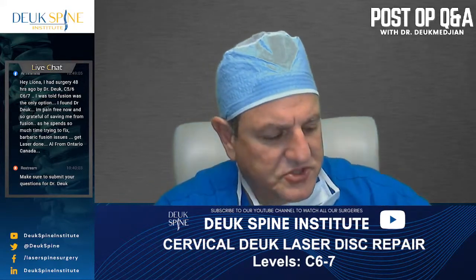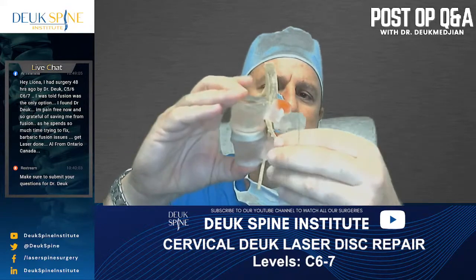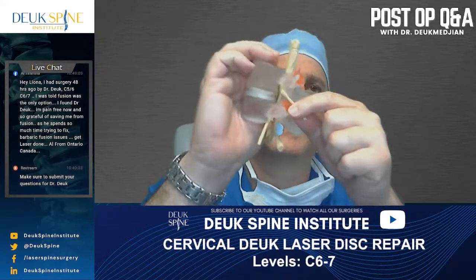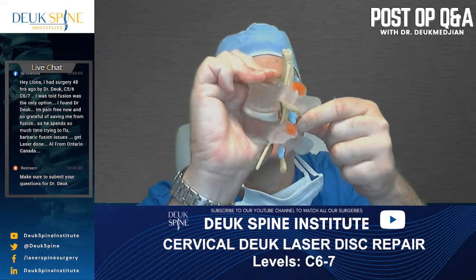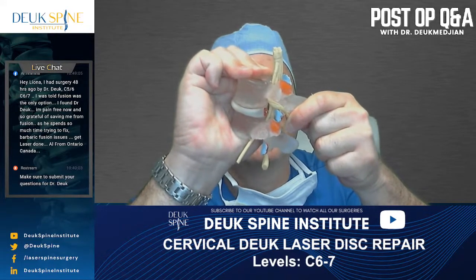And I'll show you. Let's use this model right here. This is a better model, okay? All right, you see the herniation here coming out of the tear right there. Can you all see that? Hopefully you can see it. Can you point to that, Diego? Right here. Right there, okay?